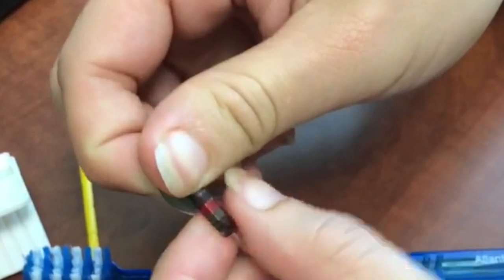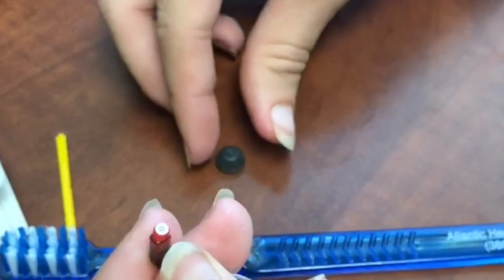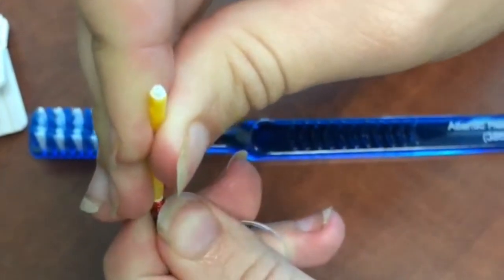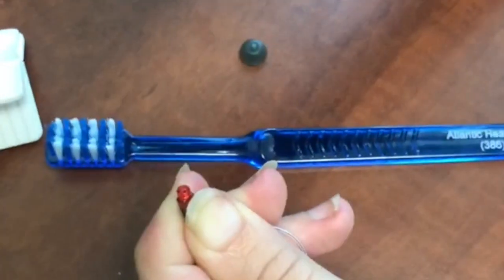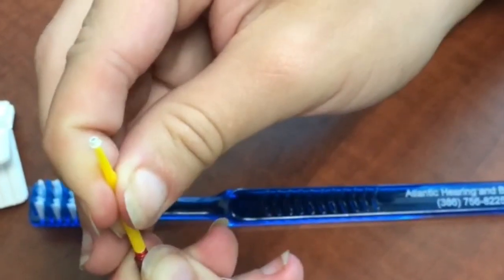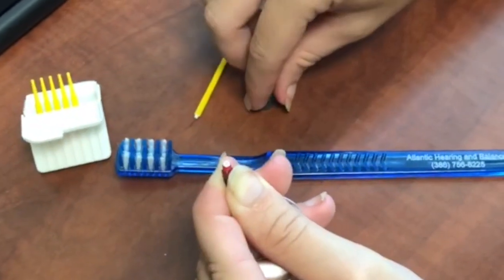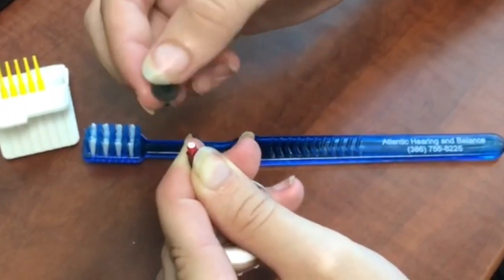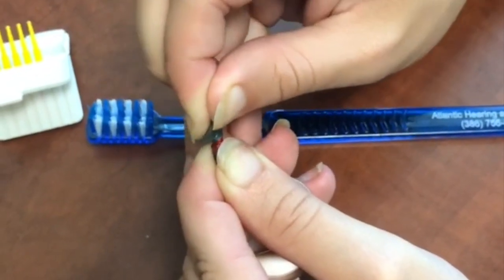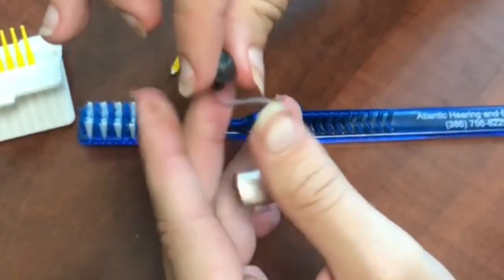First, gently pull off the dome. You'll see the white filter at the top of your speaker. Insert the side straight up and down with no white piece already on it, and then reinsert the side that did have the white piece on it to begin with. Then flip your dome over to the bottom and make sure that little circular part goes right on top of that filter, and make sure it's on there securely.